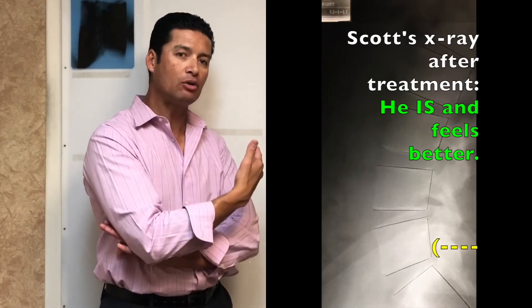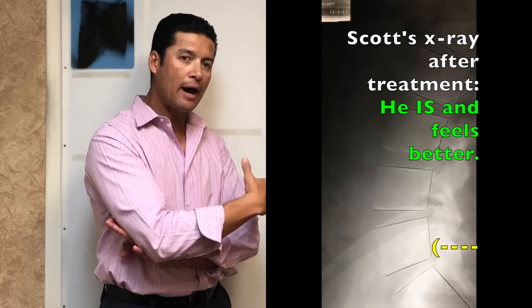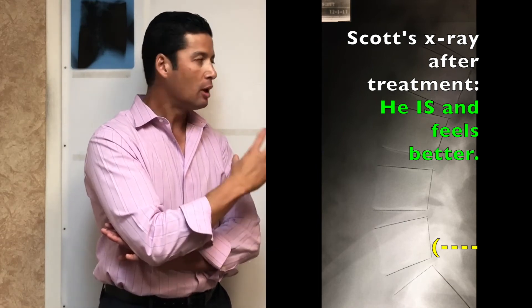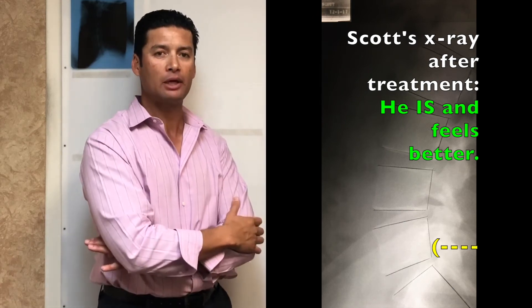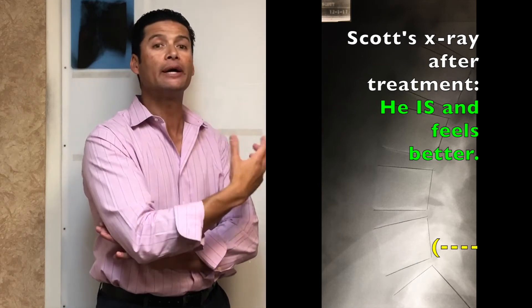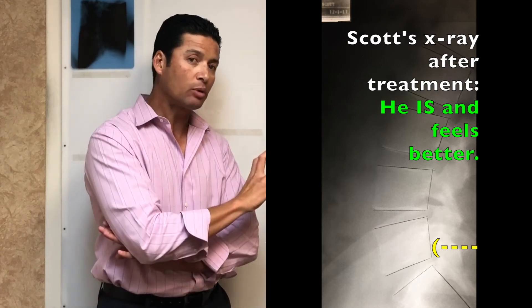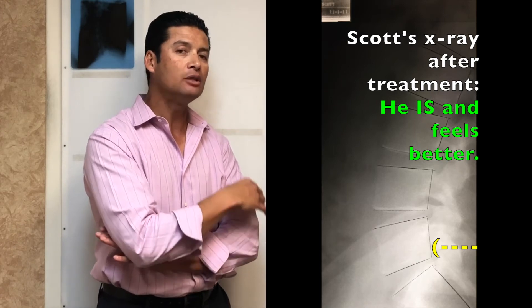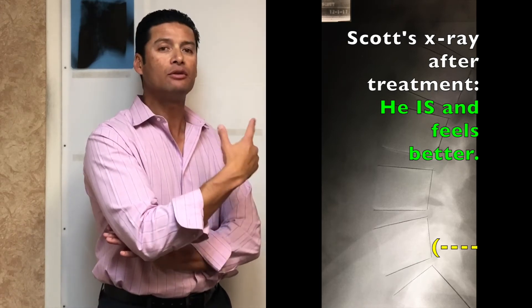Here's his new x-ray. As you can see, the bones have shifted back to better normal with a nice smooth curve in the lower back. At this point his body is about 90% better. There's still some work because there's scar tissue in there, but his body feels better. The exercise he's done has given him the confidence to do more without hurting himself. Our job is getting you back to doing those things so you feel confident the body is actually getting stronger and staying healthy on its own.